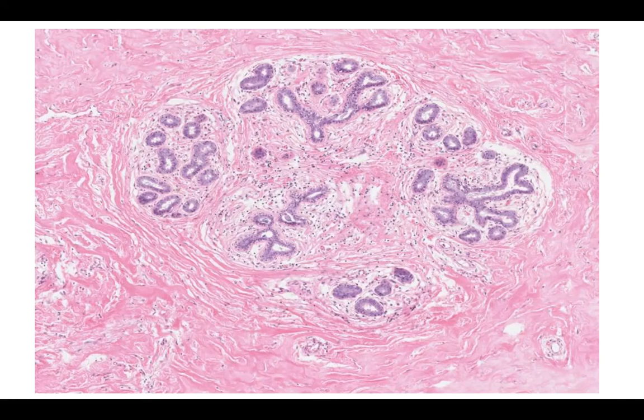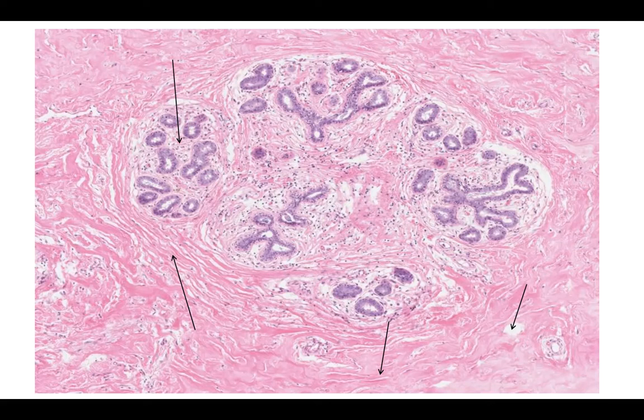In examining the stroma, we can divide it into the interlobular stroma surrounding the terminal duct lobular units and large ducts, and the intralobular stroma, which surrounds the acini within the TDLU. The interlobular stroma consists primarily of fibrous connective tissue, fibroblasts, myofibroblasts, and adipose tissue, the latter representing the majority of the adult breast volume, as we can see as these round white spaces.